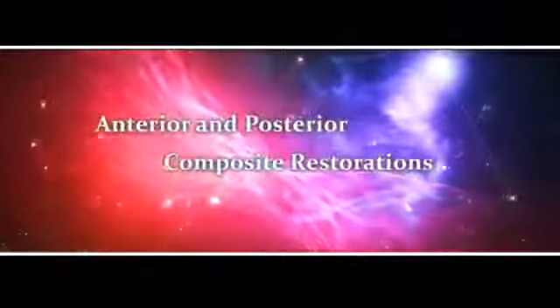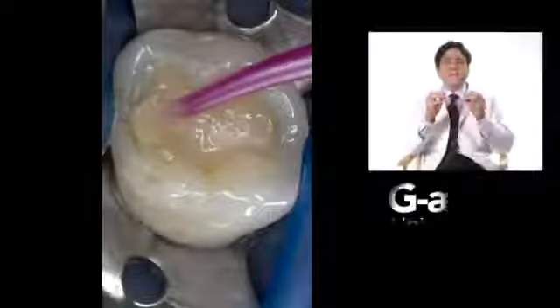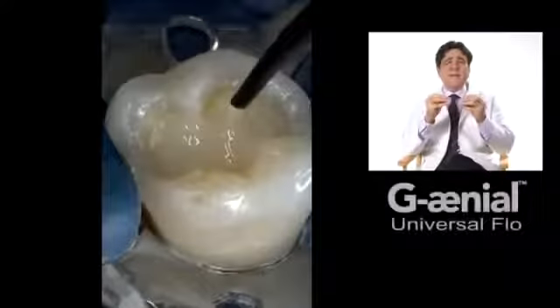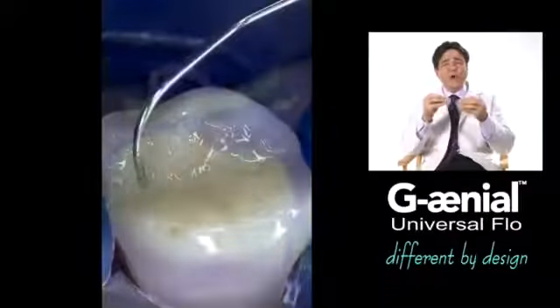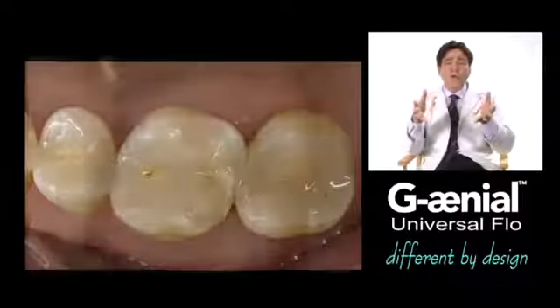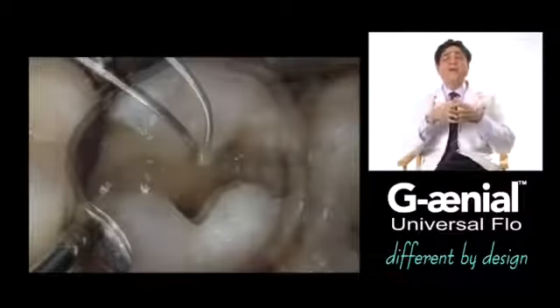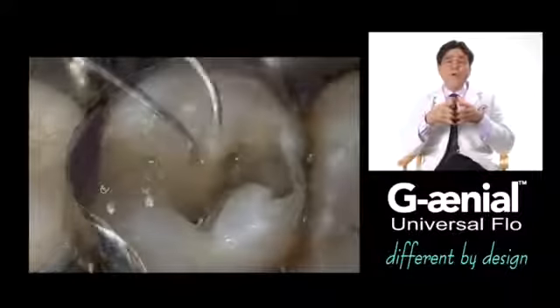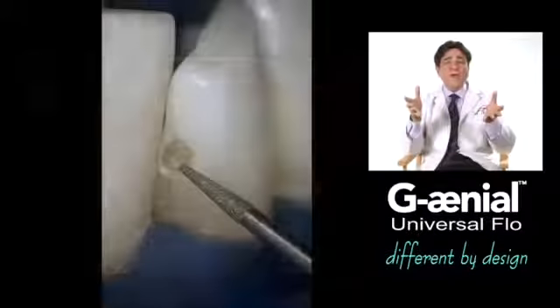For anterior and posterior composite restorations, by utilizing precise restorative placement techniques, conservative adhesive preparation designs, and a more thorough adhesive protocol, these advanced formulations such as Genial Universal Flow can be utilized for class 1, class 2, class 3, class 4, and class 5 restorations, diastemic closures, and direct veneers.